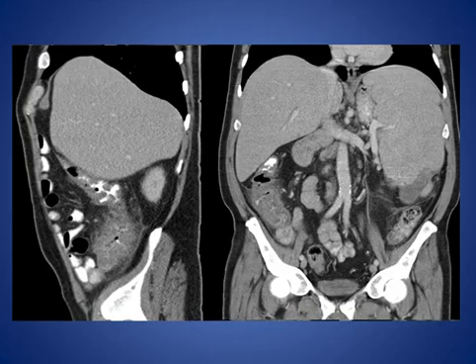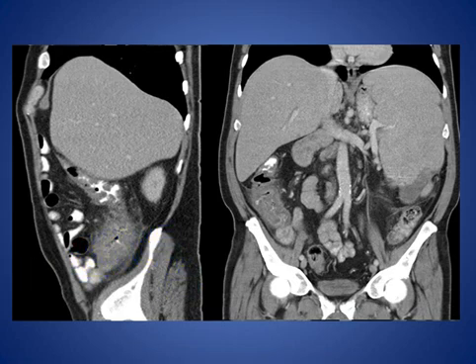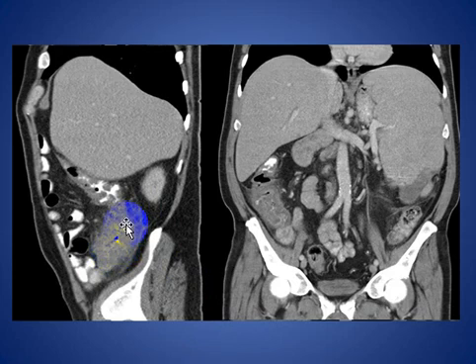Here, a 50-year-old male patient treated for leukemia presented with right-sided abdominal pain. This is an example of typhlitis, as we see here — the condition involving the cecum and ascending colon. You can see the bowel wall thickening, edema, and pericolonic fat stranding, as well as thickening of the adjacent fascia.